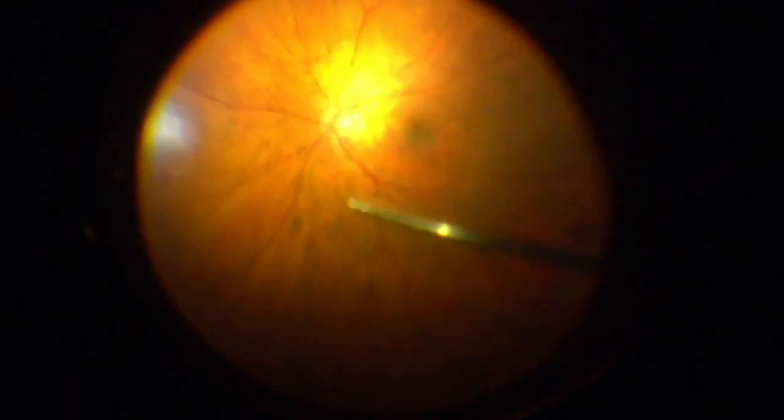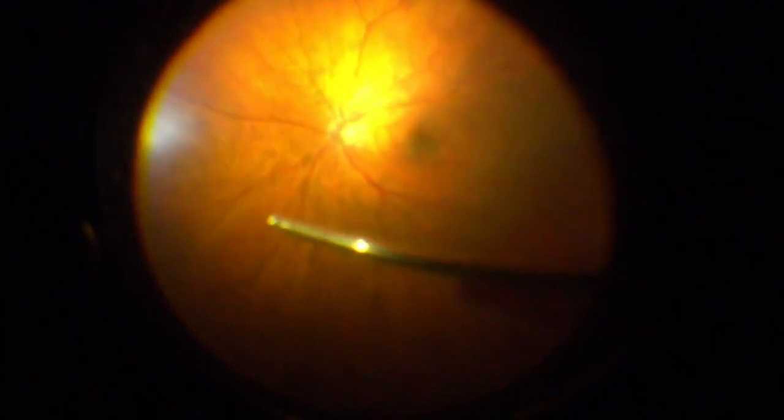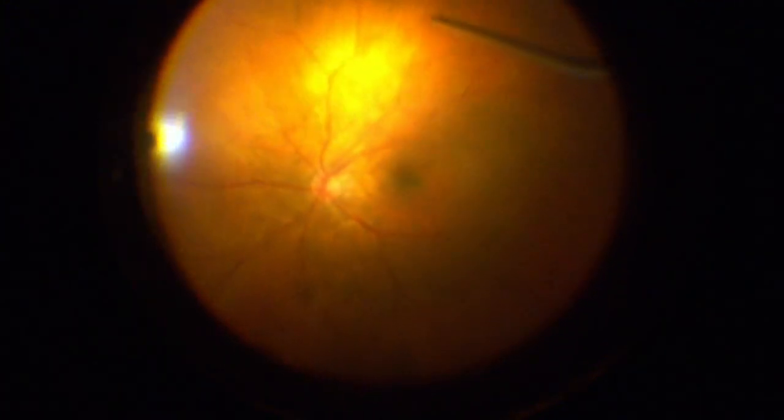We did run it up to 450 on the vacuum to pop the posterior hyaloid up there. You can see how nicely that came up. And now we're just going to trim around here.